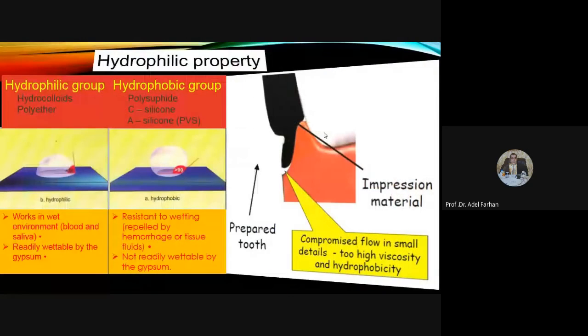الأذر ثينج بالإمبريشن ماتيريال هو الهيدروفيليك بروبرتي. الهيدروفيليك بروبرتي شي مهم بالإمبريشن ماتيريال، اللي هي الافينيتي تو الماتيريال. يعني لما نقول ماتيريال هيدروفيليك it has high affinity to moisture، أو إذا كانت hydrophobic it has low affinity to the moisture. And when we have high affinity ايش راح يسوي لنا؟ we will have a greater surface detail تعطينا بالimpression لأنه أكو surface we're going to have a greater wettability.